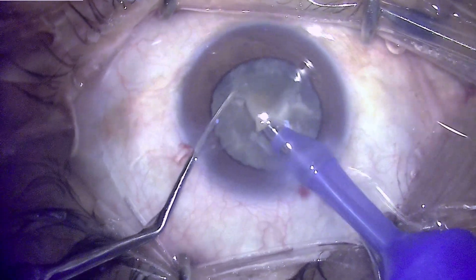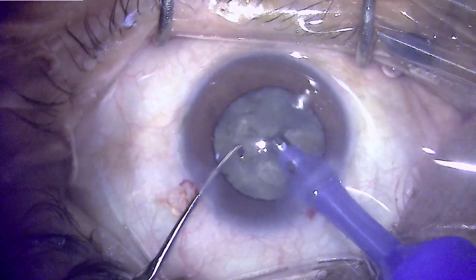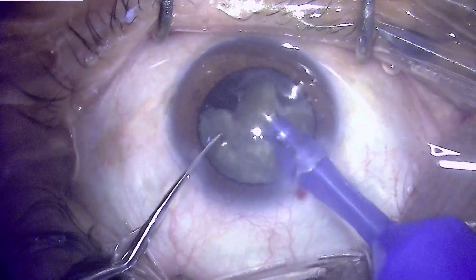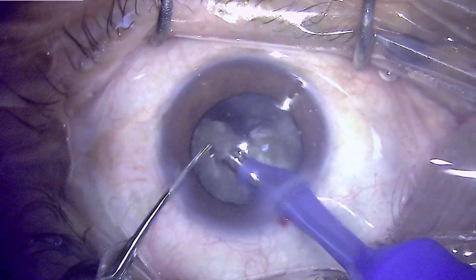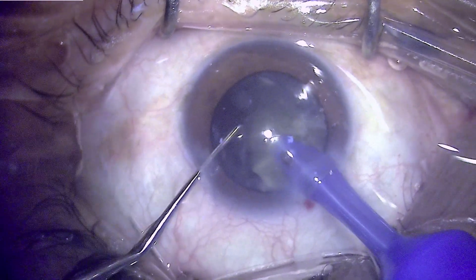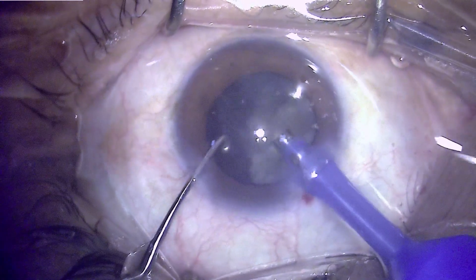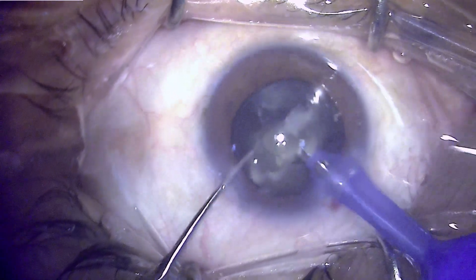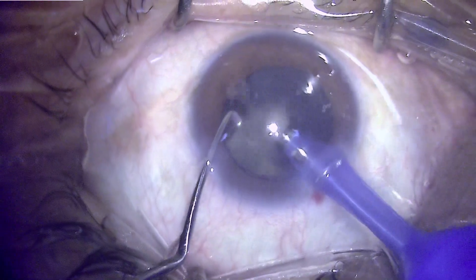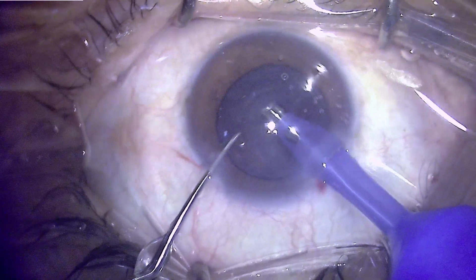Notice how efficiently these pieces are simply pulled into the phaco tip with no chatter whatsoever. This is what is desirable, so that the phaco energy is not wasted and the pieces are not cluttering around but are simply pulled into the phaco tip. There has to be a delicate on-and-off duty cycle of the phaco power, and as we can see, in just a matter of seconds the phaco has been finished and the nucleus has been consumed.